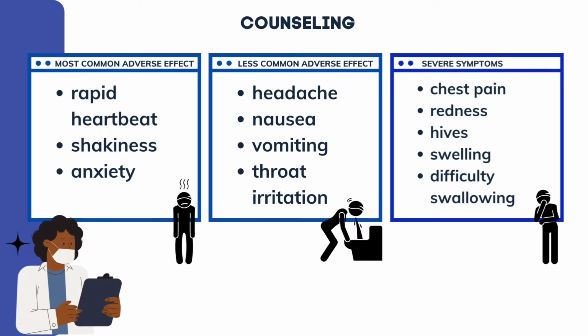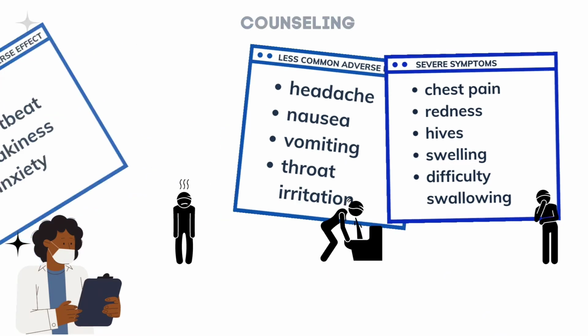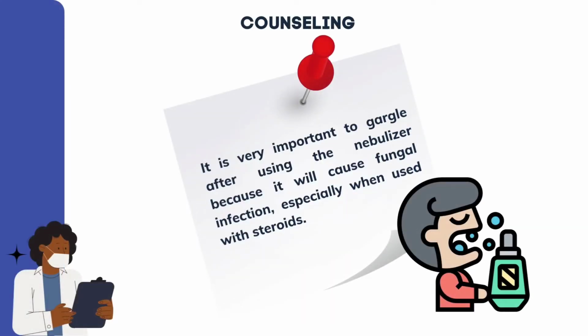Serious side effects from nebulizer therapy are also possible and should be reported to the prescribing physician all at once. Chest pain, redness, hives, swelling, or difficulty swallowing are severe symptoms. It is very important to gargle after using the nebulizer because it can cause fungal infection, especially when used with steroids.